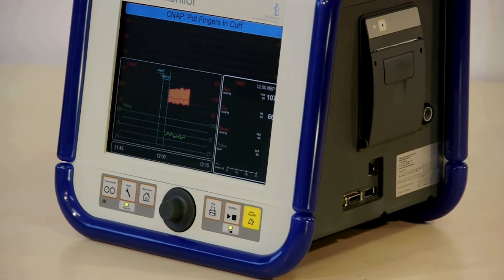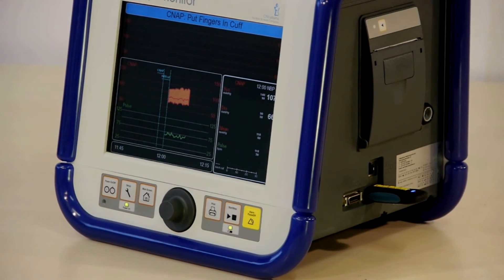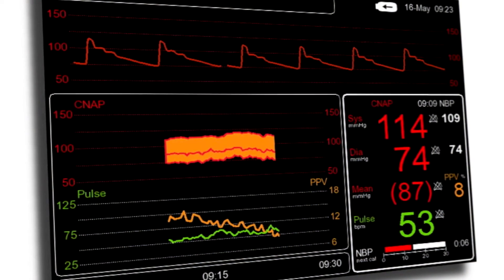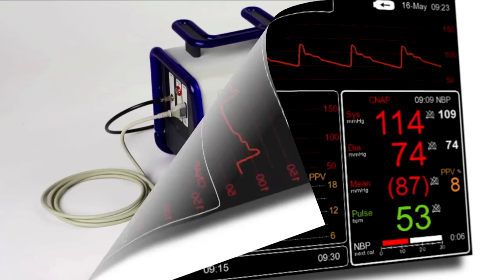To interface CNAP with other data acquisition systems, use the auxiliary analog output. An analog signal of the blood pressure tracing is available with ranges from 0 to 5 volts or plus or minus 5 volts. To download measured beat data and blood pressure tracings digitally, you can simply connect a USB storage device to the CNAP.